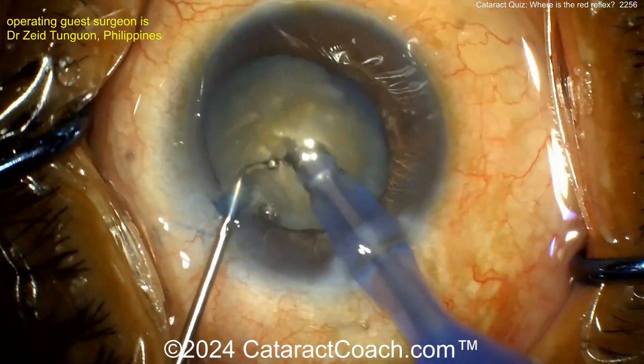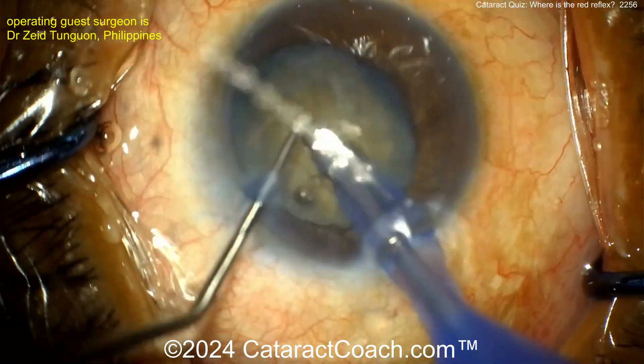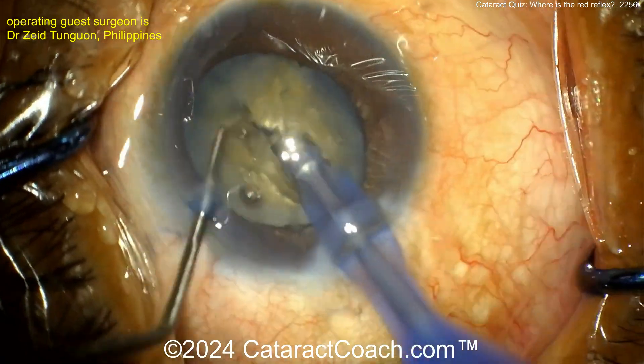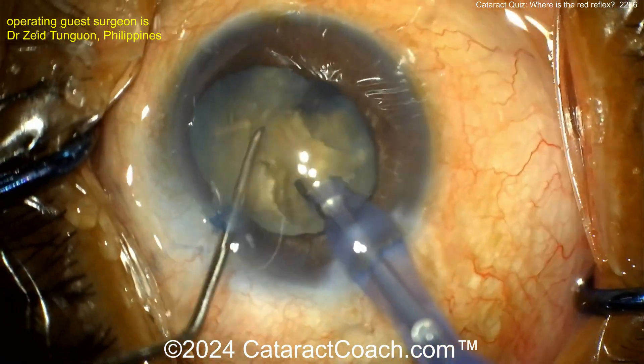Center that scope up. Making a little crunch first, then chopping and chopping again. This young surgeon is obviously very adept with the chopper — that looks great, taking these pieces down.